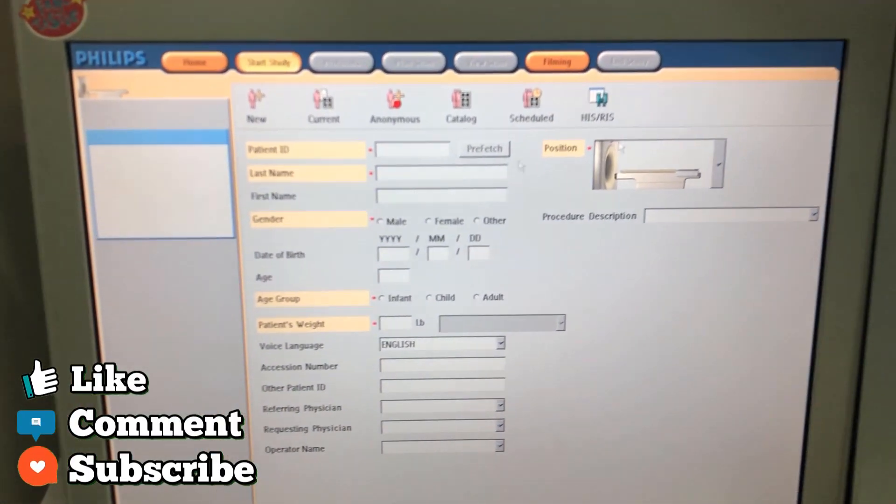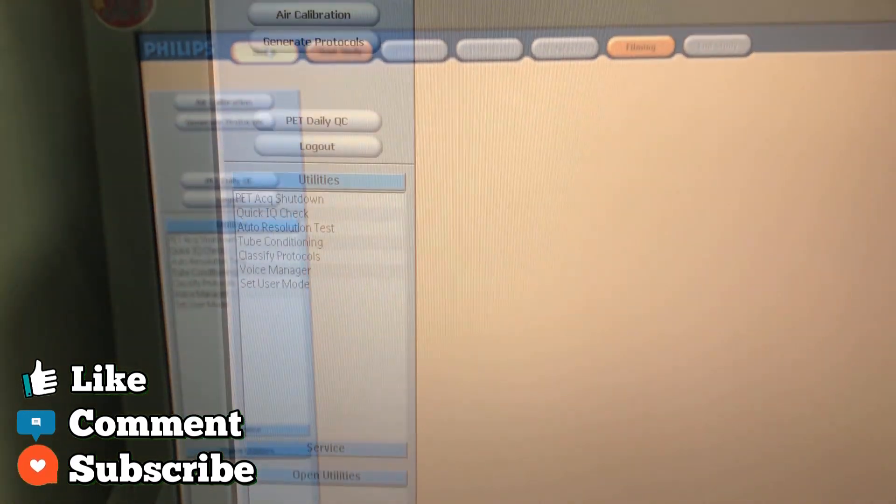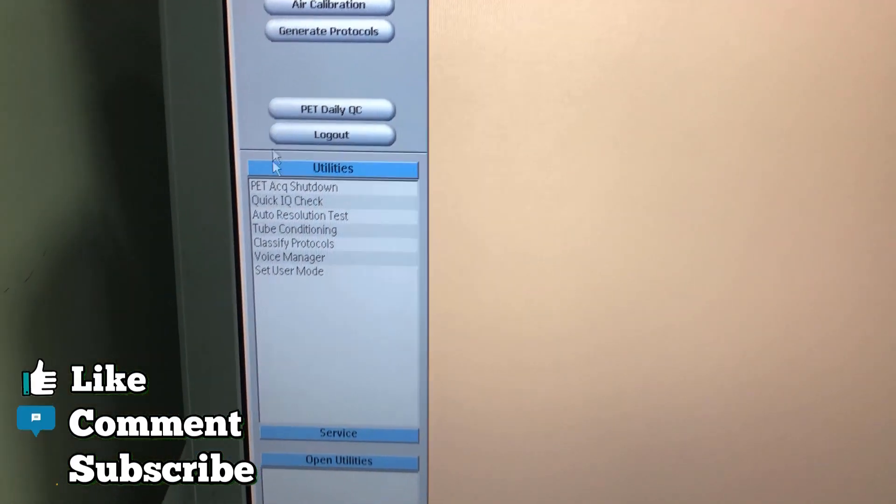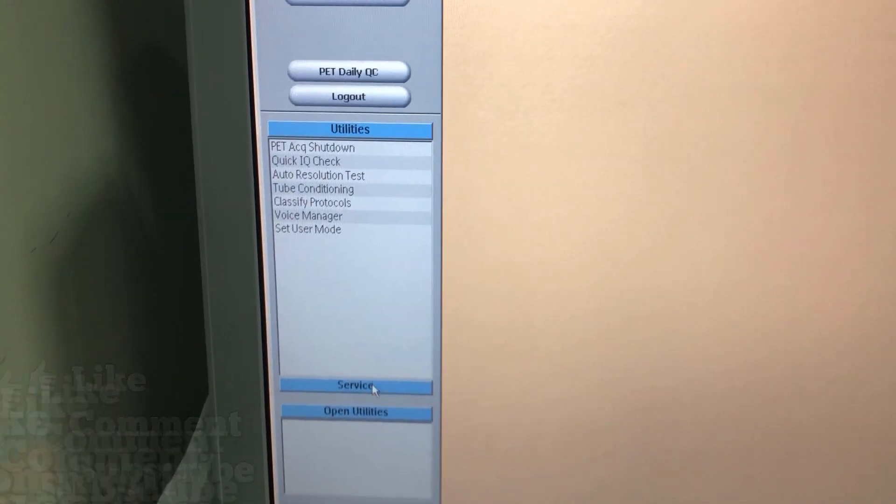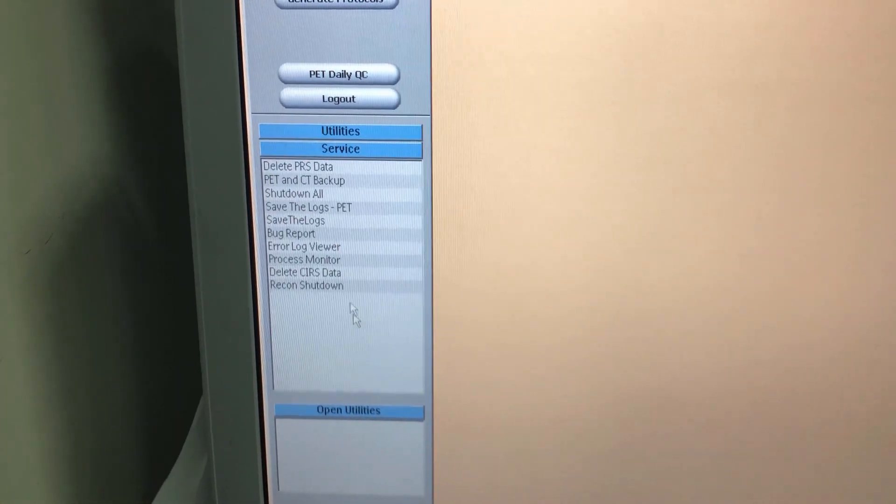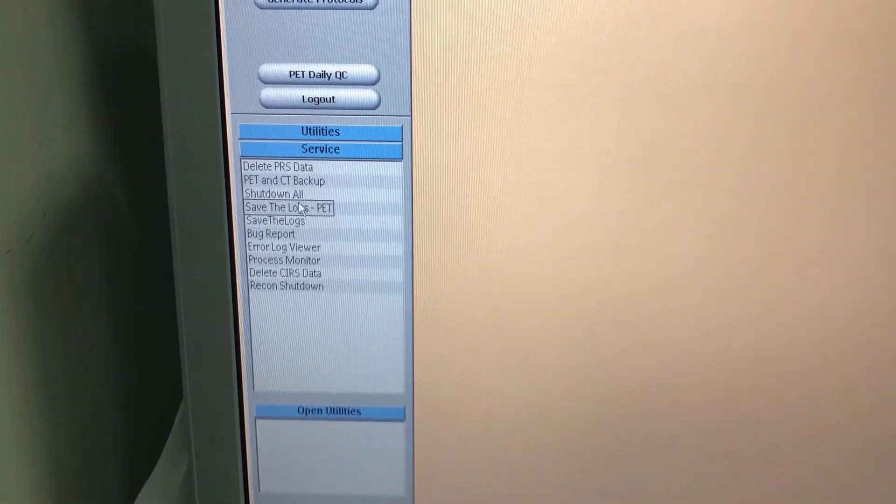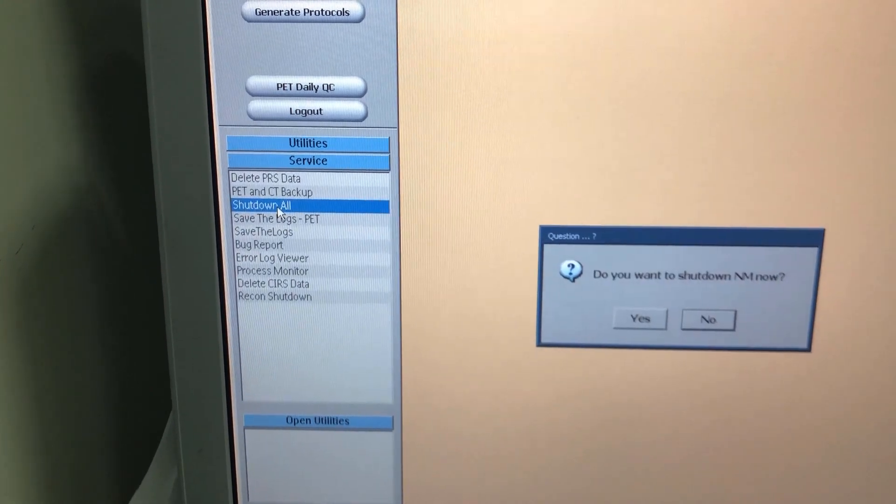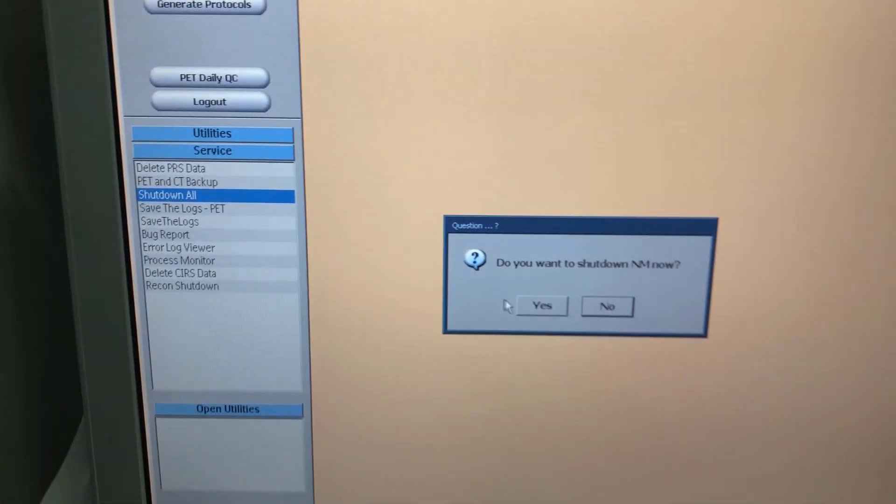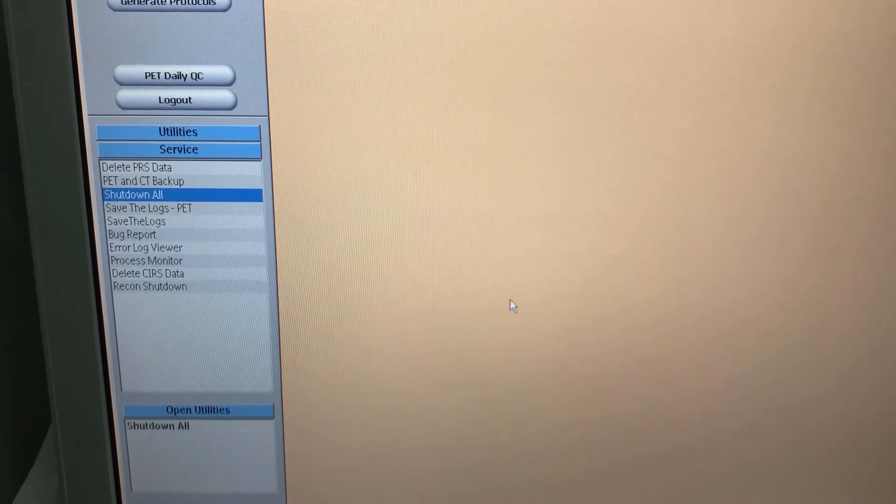Here we're going to go over to home, go down to service, shut down all, yes.